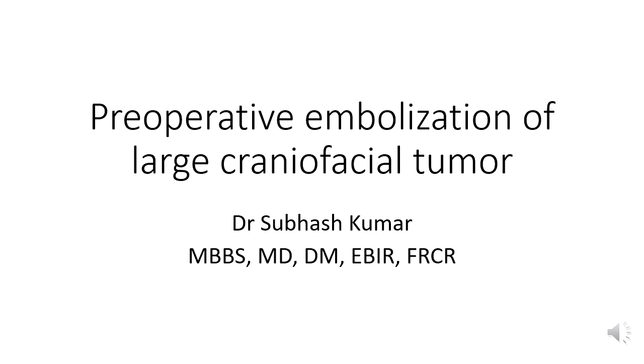Hello everyone, welcome. Today we shall review this case of a pre-operative embolization of a large craniofacial tumor in a 71 years old female patient using a combined direct puncture and transarterial embolization technique.